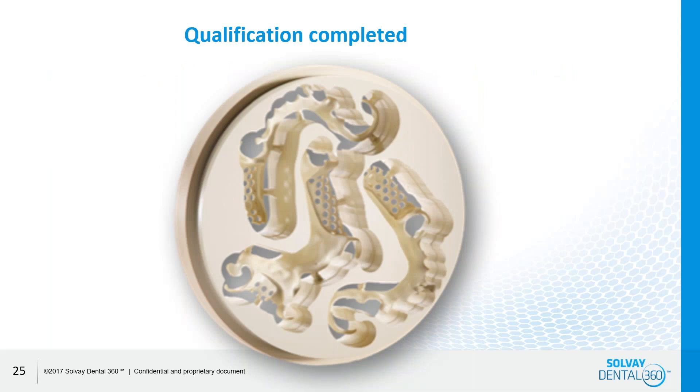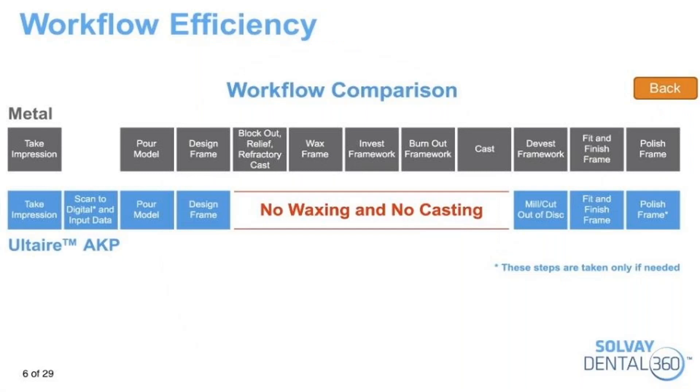You can technically fit about three frames in a disc, depending on size. In terms of process efficiency, there will be no waxing and no casting. It will allow for higher undercut engagement ranging from 0.025 to about half a millimeter compared to the old conventional way. The clasps are shorter and thicker than typical metal clasps. It is milled out of Dentevera milling discs using a specific CAM milling strategy to guarantee the required quality and precision of the surfaces.